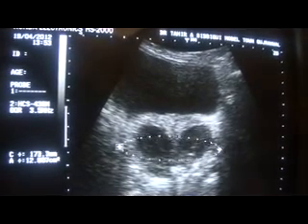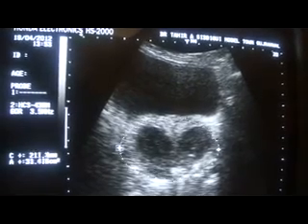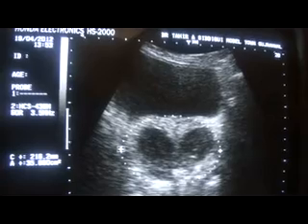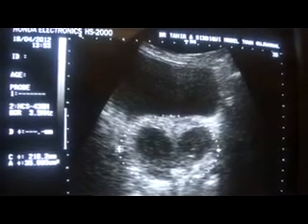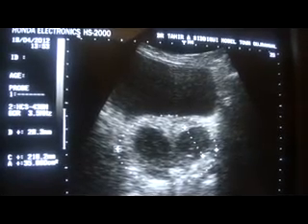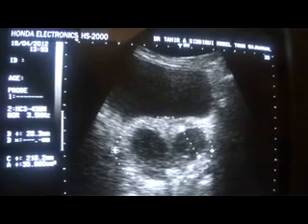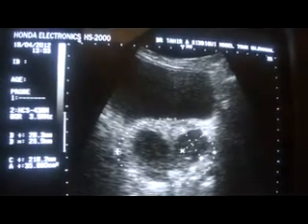This is the transverse section, this being the urinary bladder. Now note the outer surface of this focal lesion in the left lobe is well demarcated. That of the right lobe is also very well demarcated.